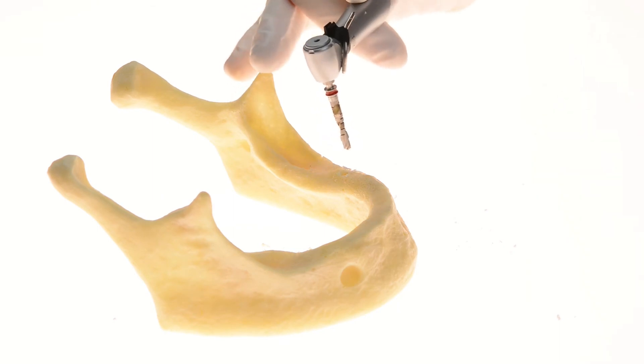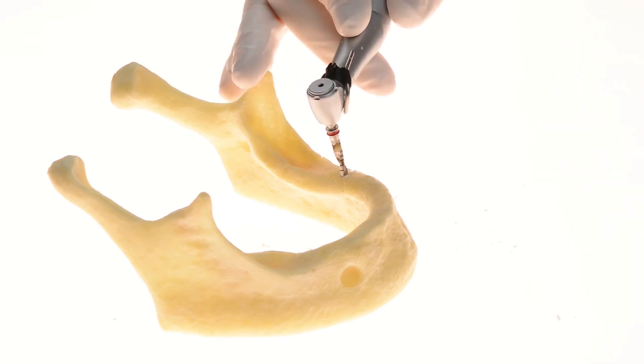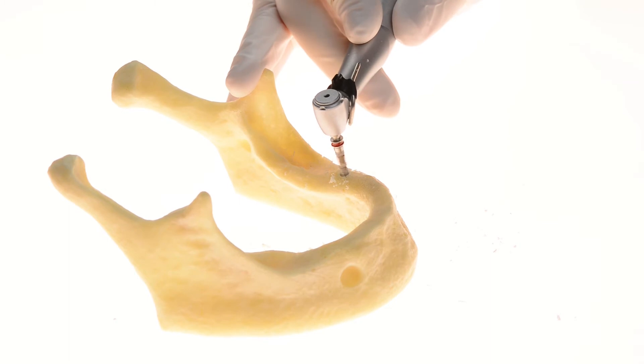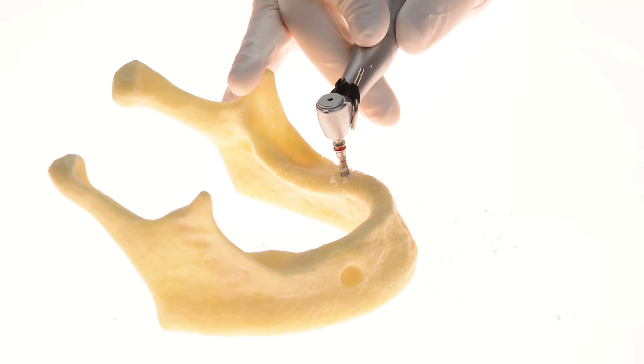After measuring the depth, we continue on to the step drill, drilling until the correct marking. The tip of this drill includes a step which is the same diameter as the previously used drill. This provides a more precise positioning of the drill inside the osteotomy and a more accurate drilling procedure overall.